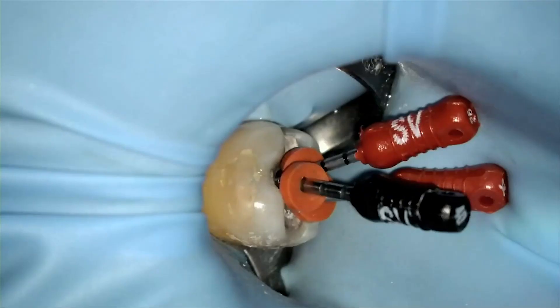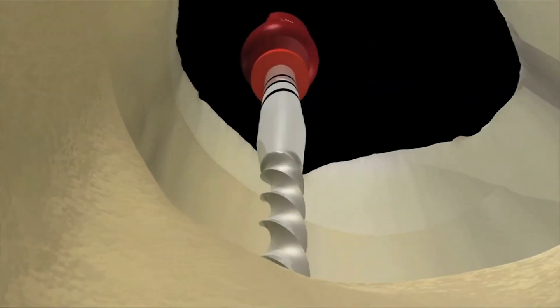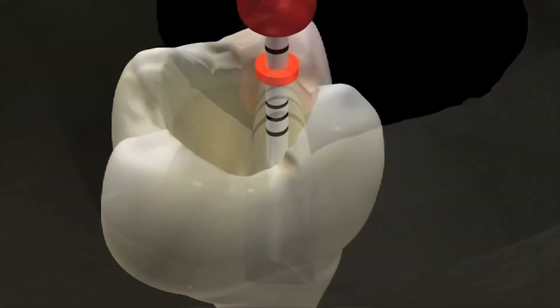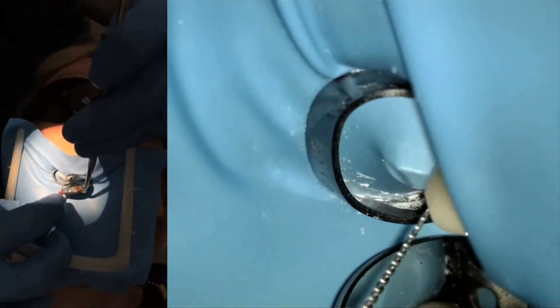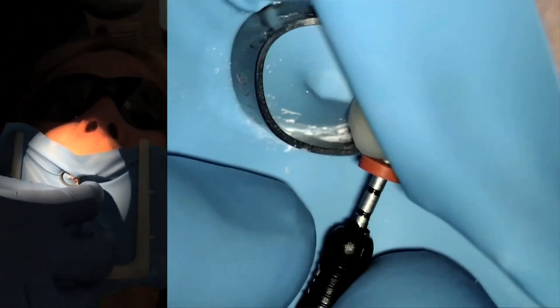I would like to stress that although its use is very simple, the size verifier is absolutely crucial in making the obturation successful and predictable. The main purpose of the size verifier is to ensure that your Gutta Core will have a clear path in the canal all the way to the working length. The size verifier also serves as a radiographic confirmation of your working and obturation length. Using the size verifier would be the same as if you were to fit and radiograph a master gutta percha cone. The size verifier should encounter little or no resistance when at working length, helping ensure the canal is ready for obturation with the corresponding Gutta Core.